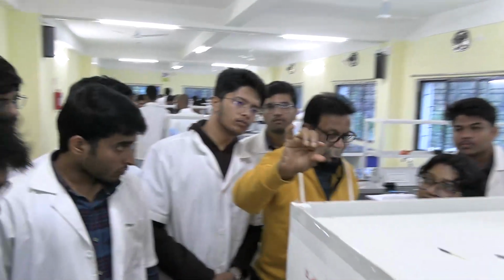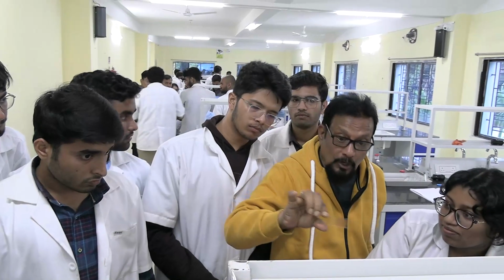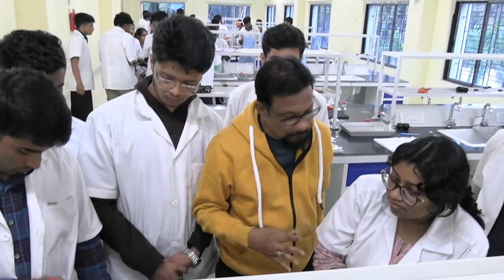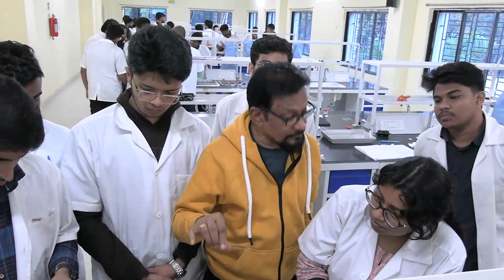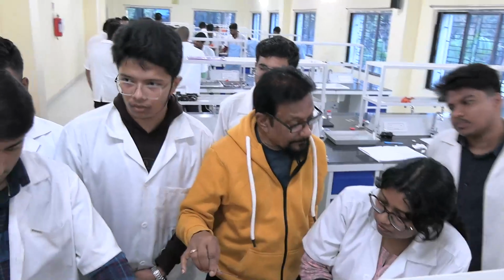You see how, not too much, not too less, and the slide is clean. That's it. So you will carefully do it. Cleaning is very important, and how much blood you are taking is also important. This should not be a very big drop.